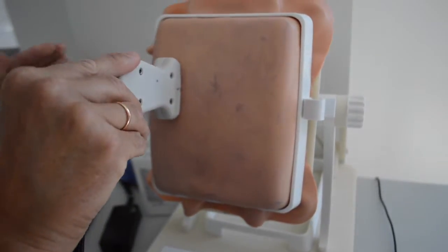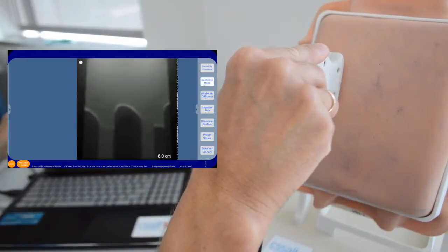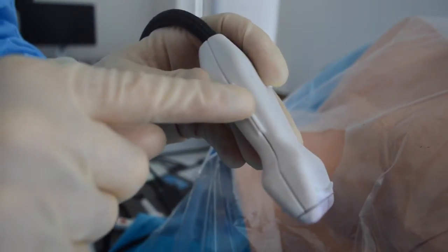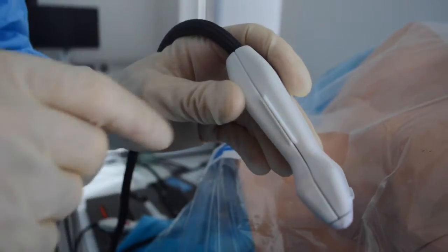Once you place the probe on the simulator, you will see the ultrasound image pop up on the computer screen. Notice that the orientation marker is in the top left corner of the ultrasound image. This orientation marker corresponds to the orientation marker on the ultrasound probe.